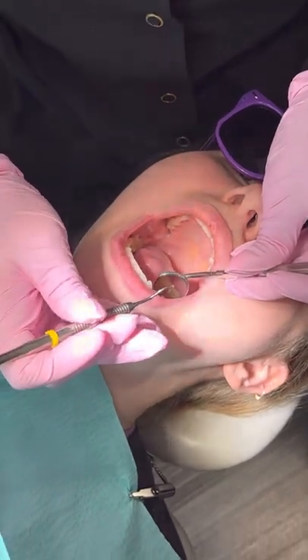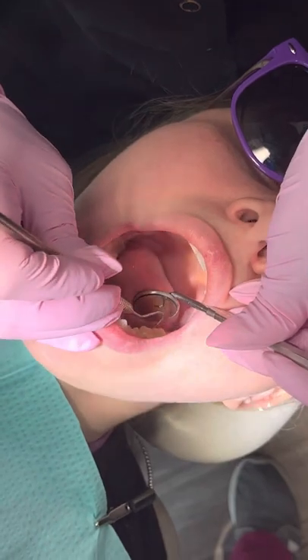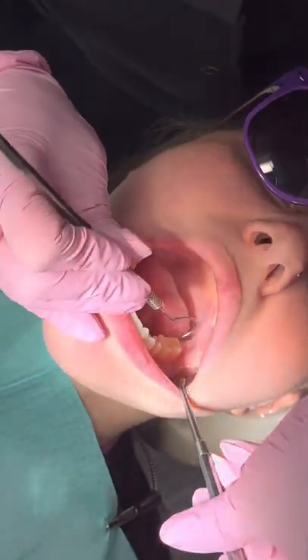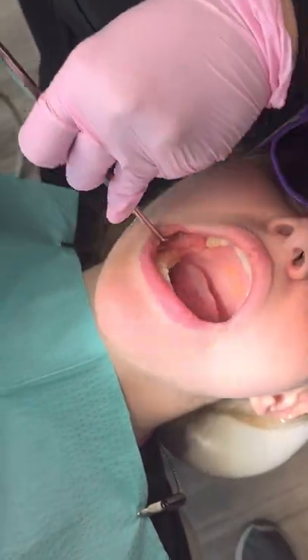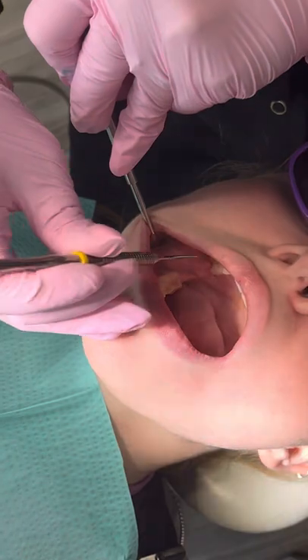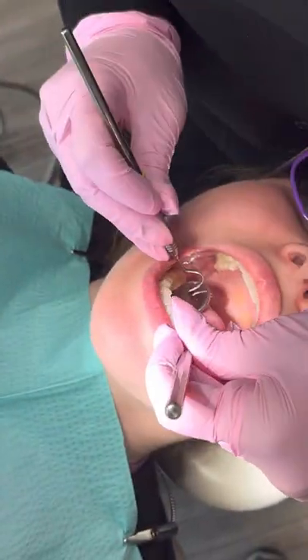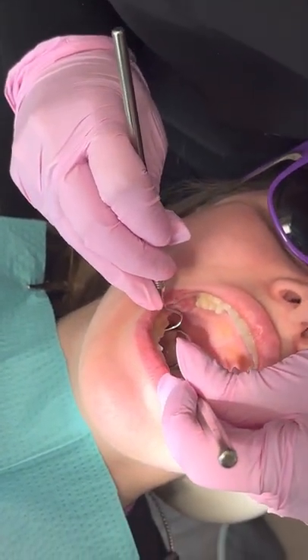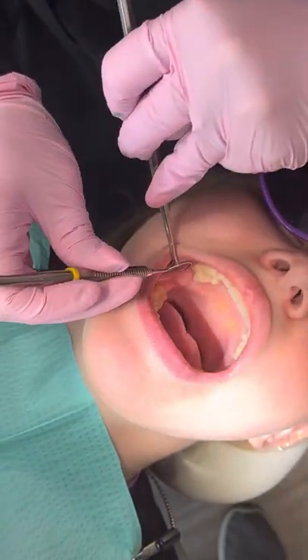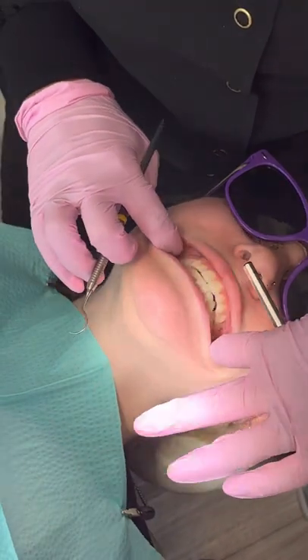Going down on the lower arch, I'm going to use the mirror to retract the tongue. For this side I'm going to use that mirror for indirect vision and use the explorer to directly scrape. Then pull it out and check those buccal pits to see how those are looking. Now hopping onto the other side, again using the mirror to retract, checking those buccal pits and the occlusals. I'm going to use my mirror to look in and see if there's any plaque buildup, scraping along those linguals. Lower linguals and upper buccals are the most common areas to have plaque.